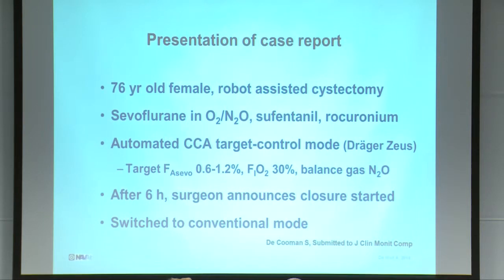So after 6 hours, the surgeon announces that the closure has started, and the anesthesia provider switched to the conventional mode.